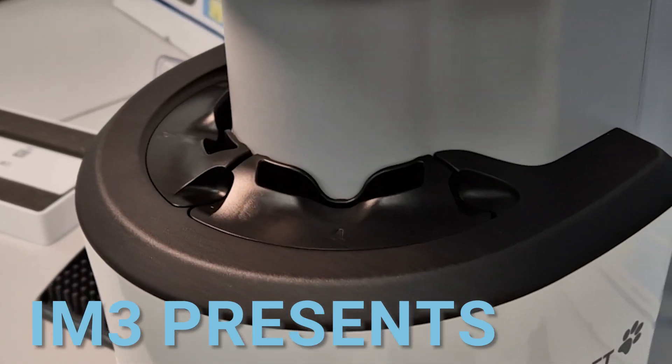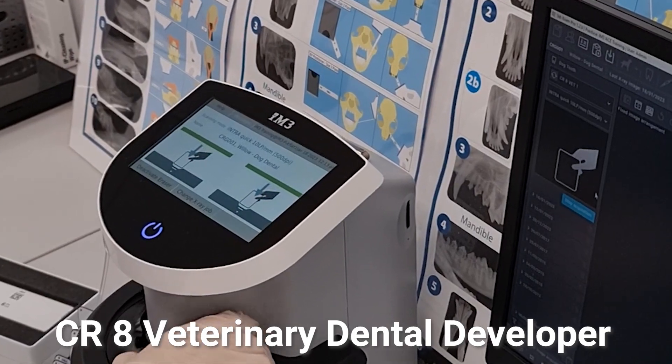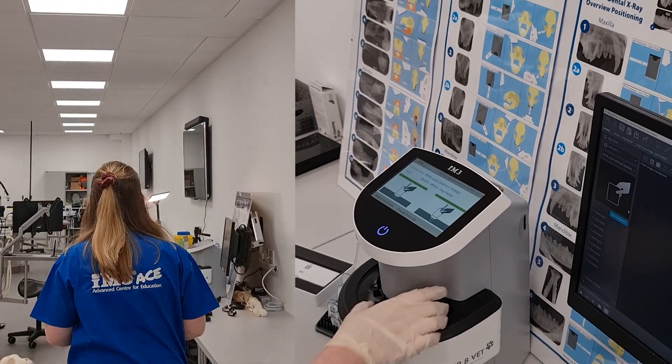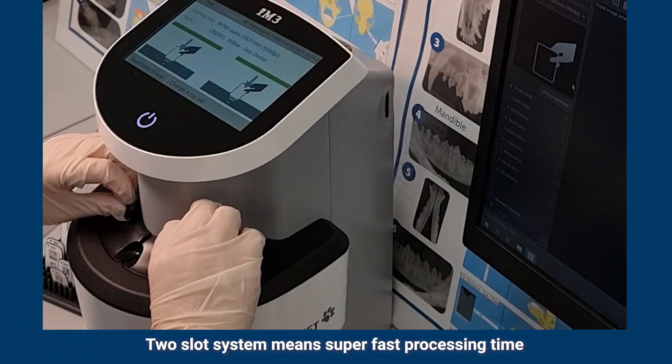IM3 presents the CR8 veterinary dental developer. The two-slot system means super fast processing time.